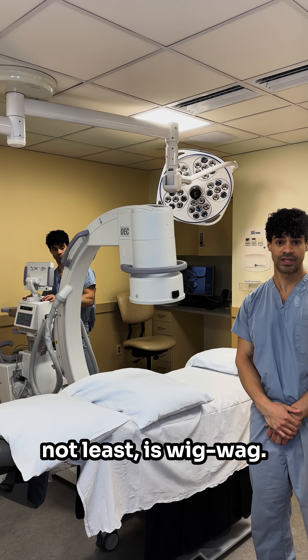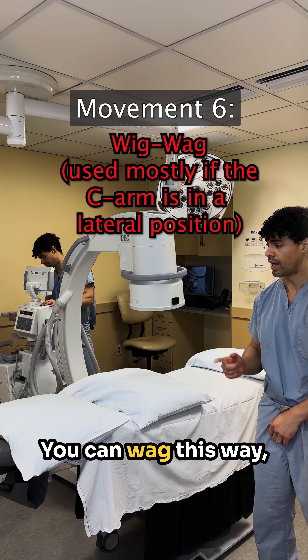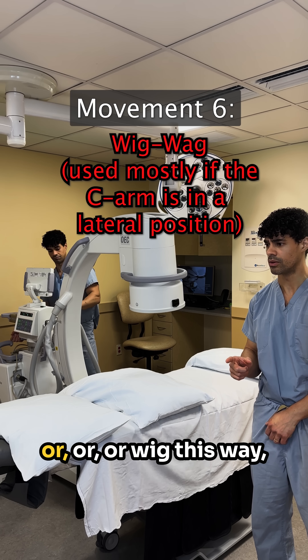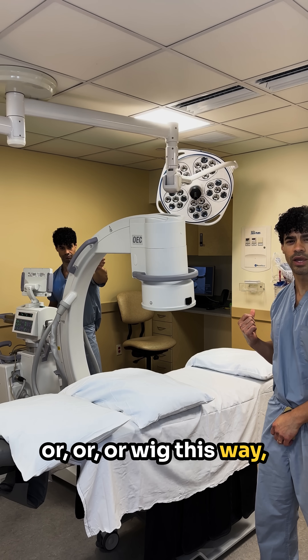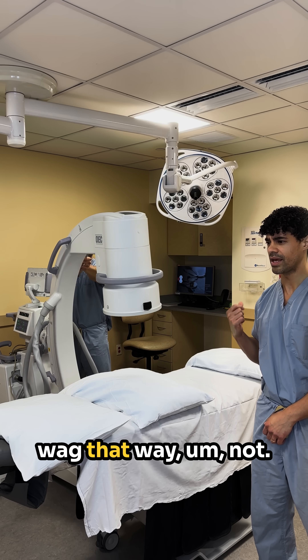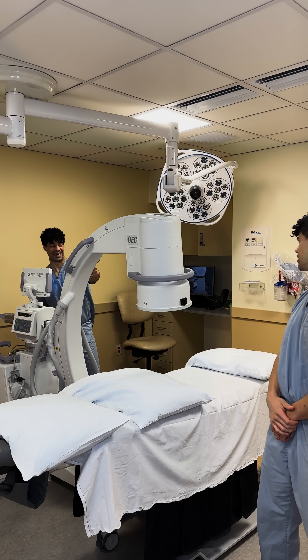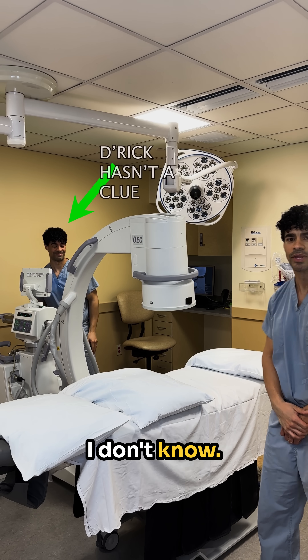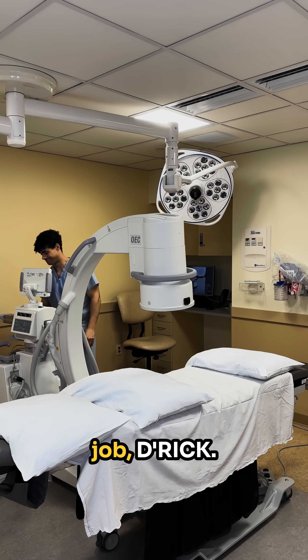Last, but definitely not least, is wigwag. You can wag this way or wig this way — or wig this way and wag that way. I'm not quite sure. Anyways, good job, Drick.